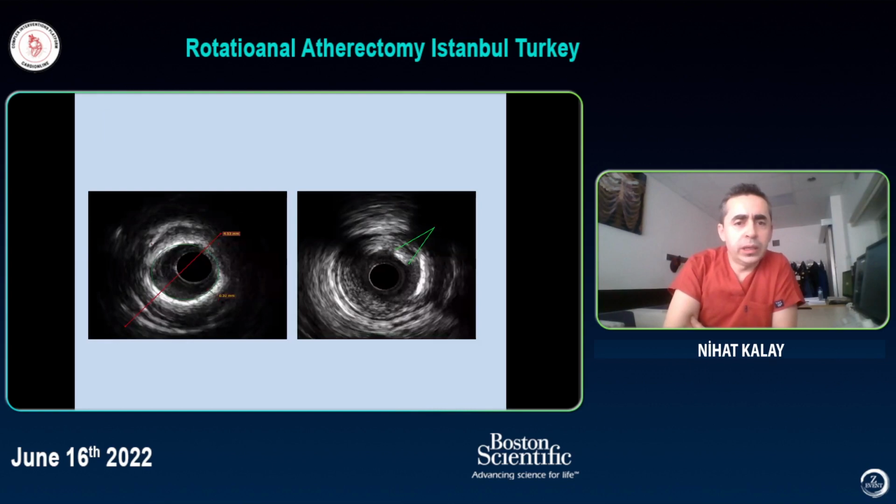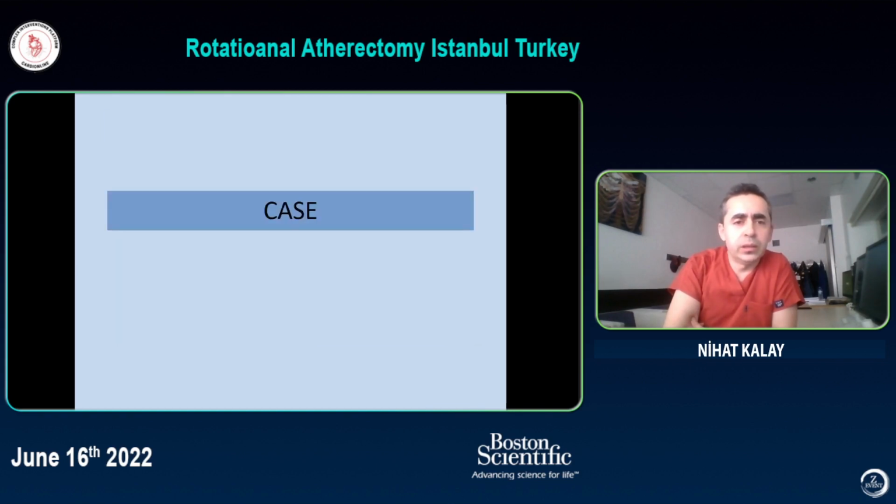Calcified nodule, you can see at the 2 o'clock position, with circumferential calcium.